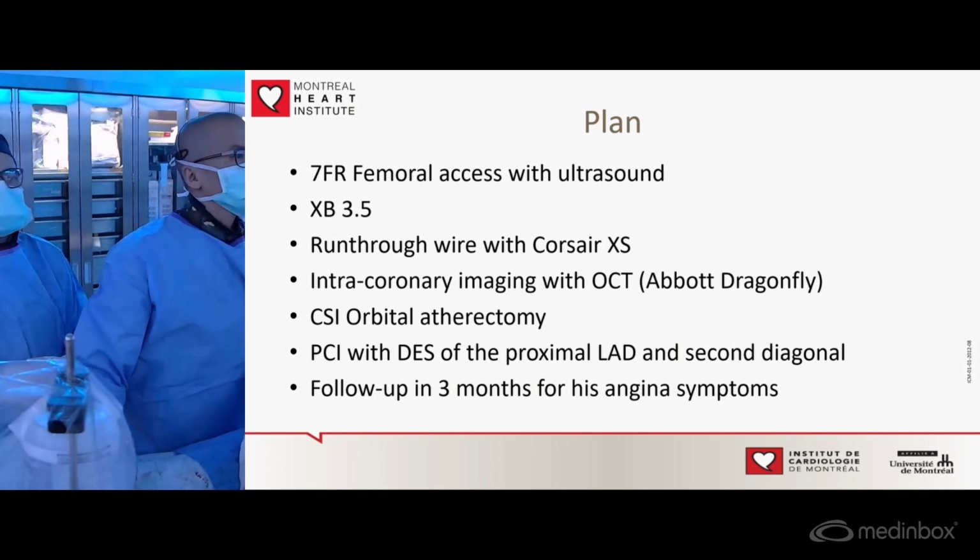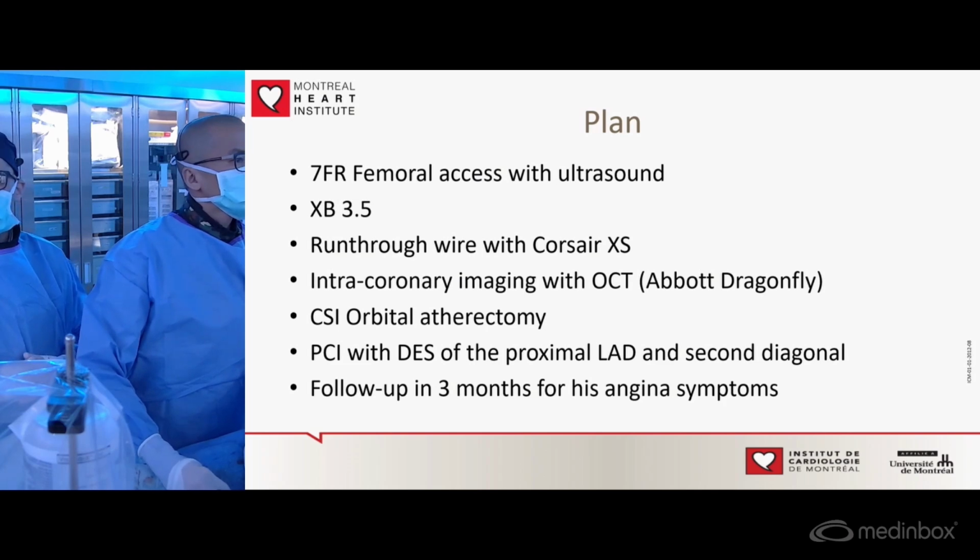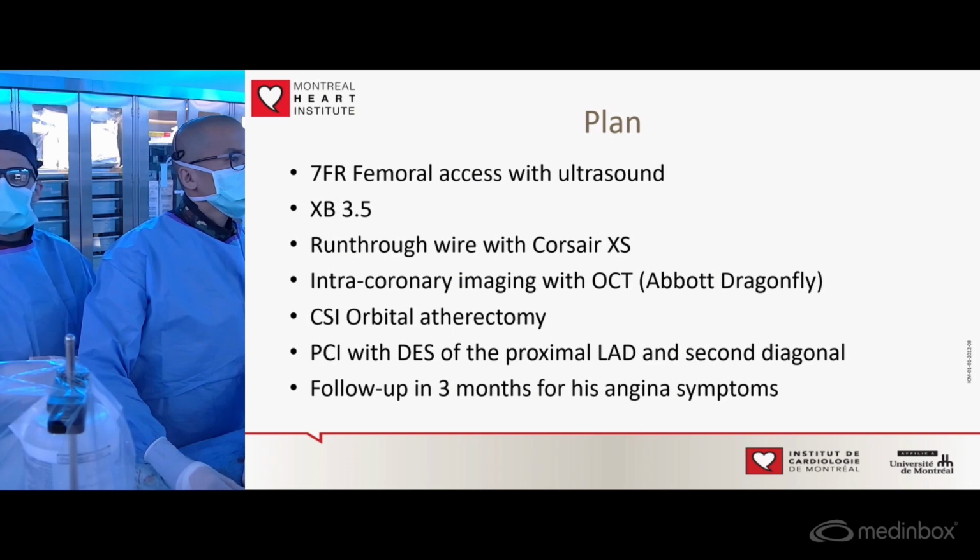Today, our plan is to open the proximal LAD and the second diagonal with some calcium modification techniques while using intracoronary imaging, based on the RENOVATE-COMPLEX-PCI trial that has shown superior results and lower MACE events with the use of intravascular imaging for complex PCIs like this case.